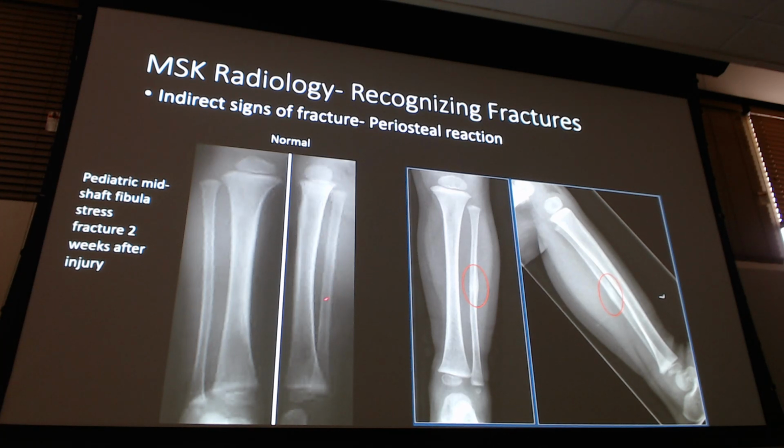I really don't. Maybe if I could scroll, maybe, but that cortex looks like it's pretty well connected all the way down. But then look at 2 weeks later, I have a periosteal reaction, which means there was some kind of hairline fracture there that just wasn't noticeable. Now, is that a big deal for the kid in the shaft of the bone? No, not really, right? But mom's probably bringing them back in 2 weeks because they probably still hurt a little bit, they're still limping, and then you do the x-ray, and you turn around and you go, oh, there was a small hairline, but it's healing well. I can see the periosteal reaction there. Nothing we need to do about it. Just continue to watch it. If you're limping or taking your time on it, that's fine. I mean, it's not going to displace or anything like that, so you just tell mom to be careful.